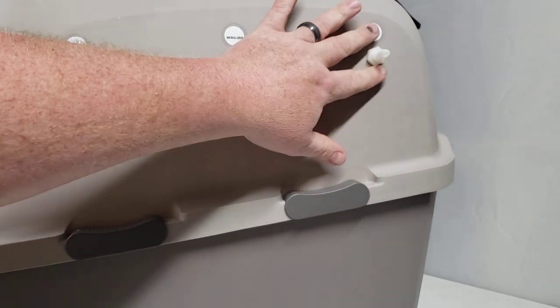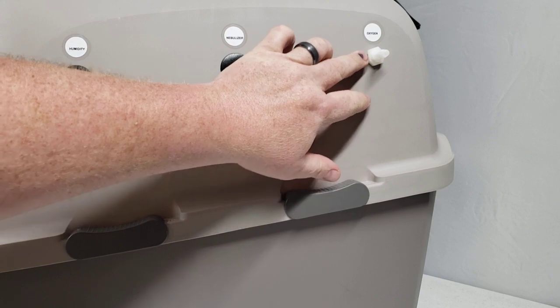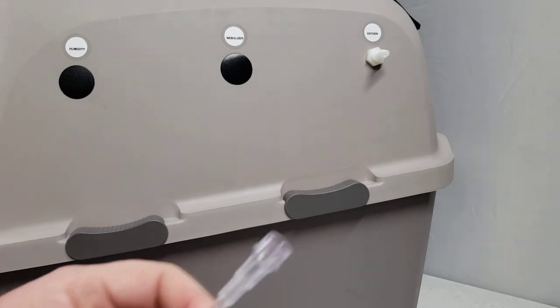The Puppy Kitten and Pet Incubator ICU comes with our very unique two-way oxygen connection already attached to the unit. You should have some standard oxygen tubing that came with your order from us, or it came with your concentrator or tank.